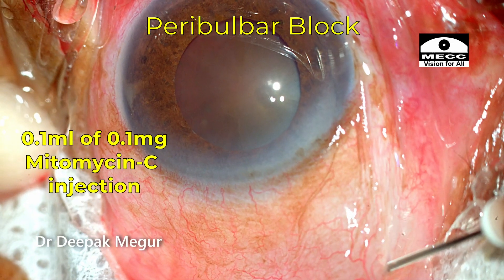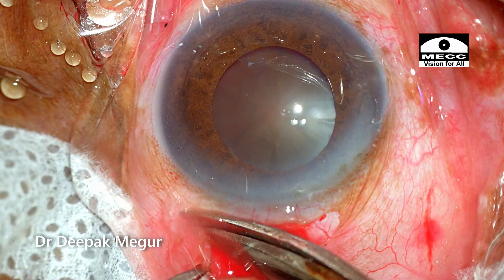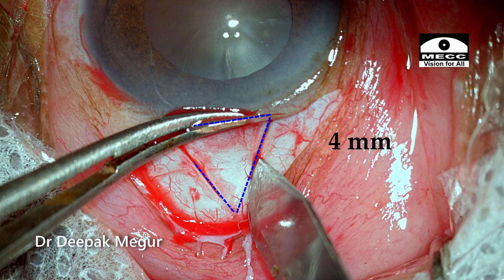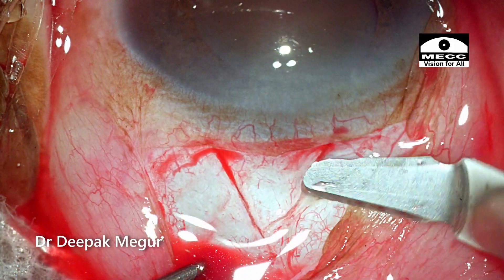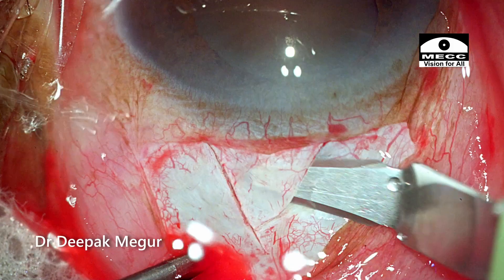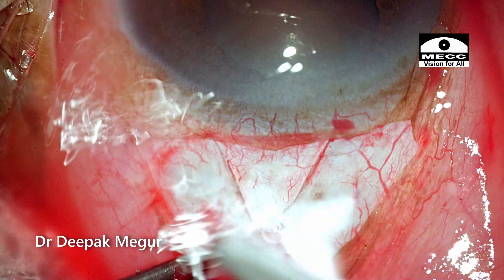Mitomycin C injection is given in the subtenon space. The conjunctival flap is being created. My plan is to use a triangular flap, which is what I typically use. This is around a four to five millimeter long incision. The depth of the plane is decided by the appearance of the blade under the flap — it should just be visible. That indicates the plane is ideal and we don't have too thick or too thin a flap.